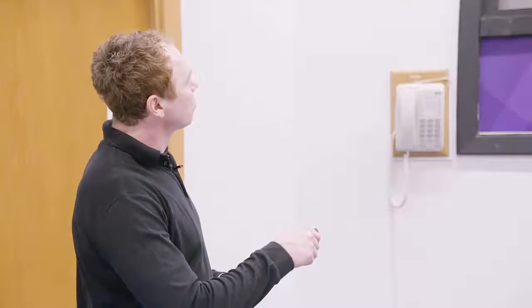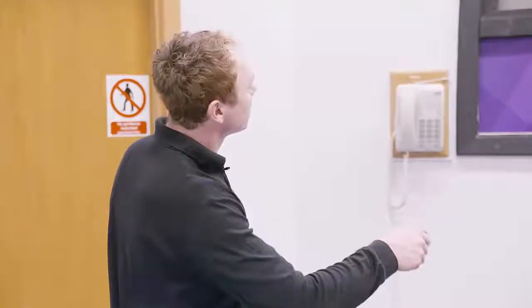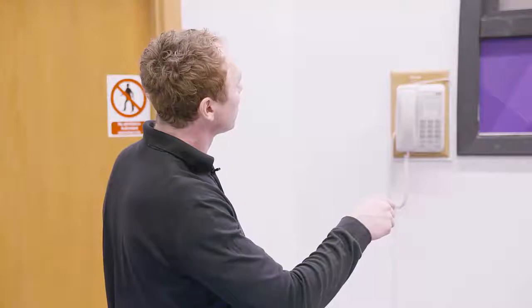Then you get a really detailed graphic and numeric comparison between reference values and values for this subject, and in this case between left and right side. So you can go muscle by muscle and compare. What you would like to see, of course, is two curves right on top of each other, especially up to here. Like I said, this second part is not so very stable, but from time 0 to the maximum peak, you would like to see about the same times and about the same amplitude as possible.